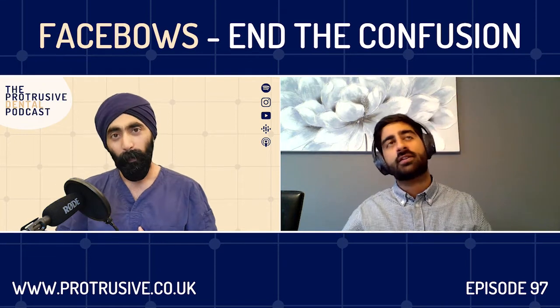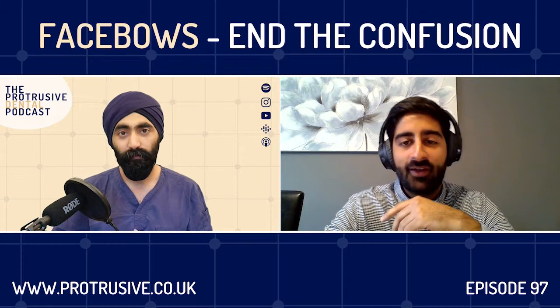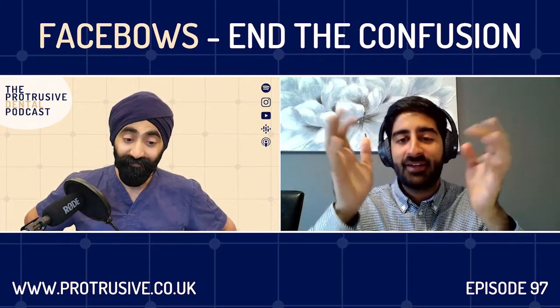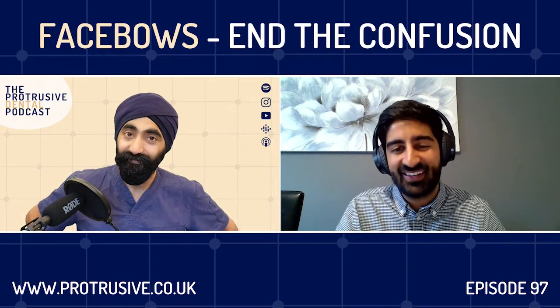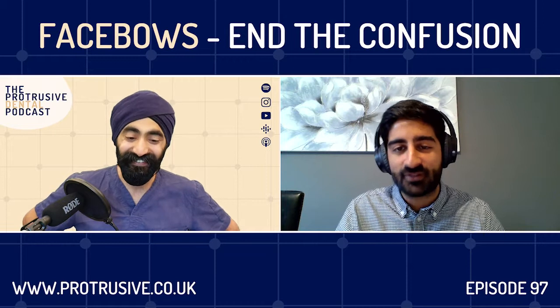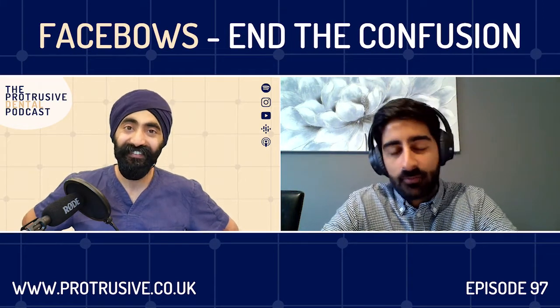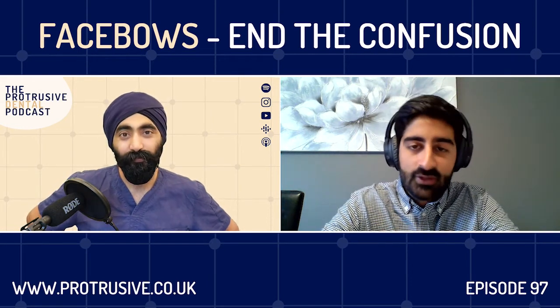Yeah. So firstly, Jazz, the reason I thought cants became so important for me is when I started at the Eastman, and I got my first set of study casts for my patient, and I put them on an articulator, and I looked at it and I thought, where do I begin? Because there's no starting reference points, and that's where I got involved in cants and figuring out how they work. So the microbrush and the stick bite technique that people use is essentially using silicone bite registration paste.